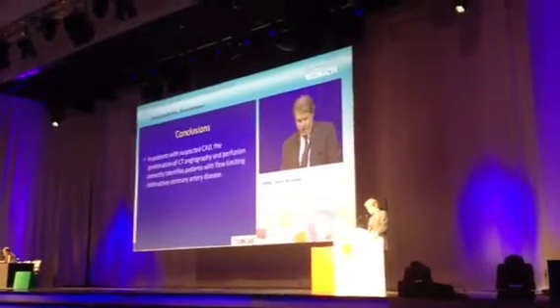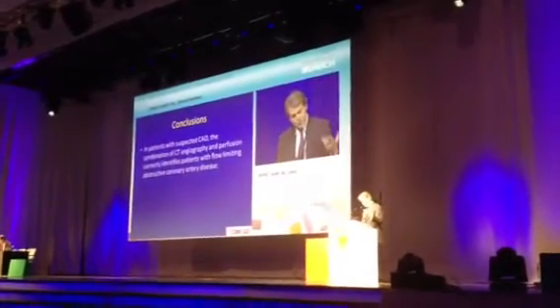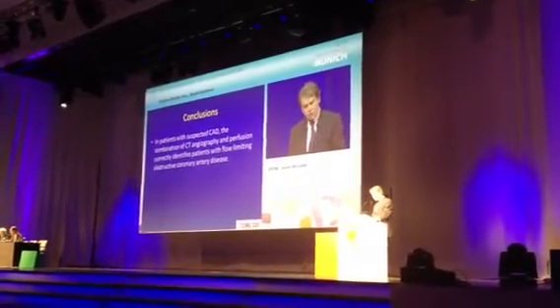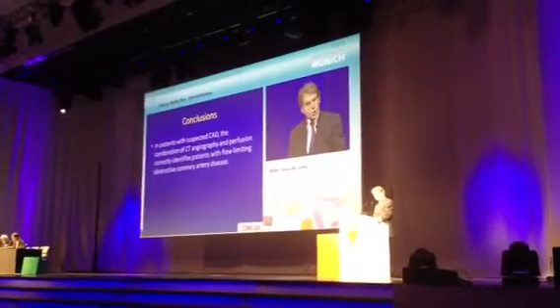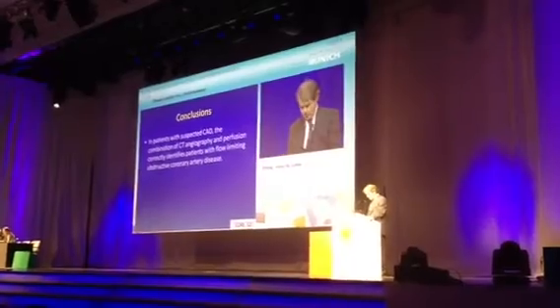In conclusion, ladies and gentlemen, in patients with suspected CAD, the combination of CT angiography and perfusion correctly identifies patients with flow-limiting obstructive coronary artery disease.